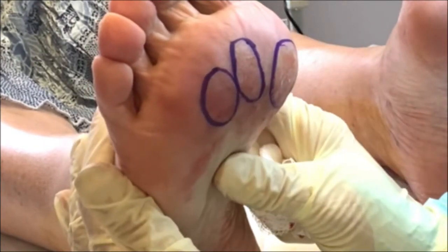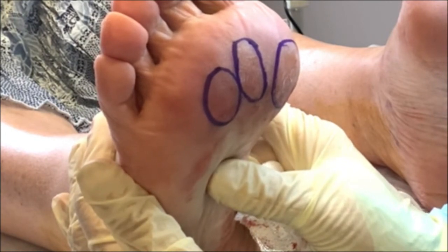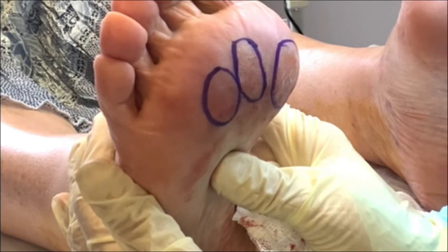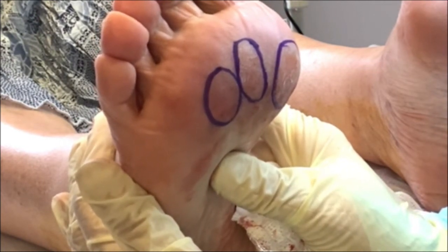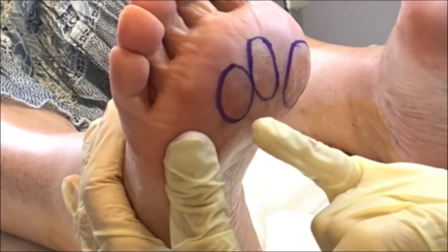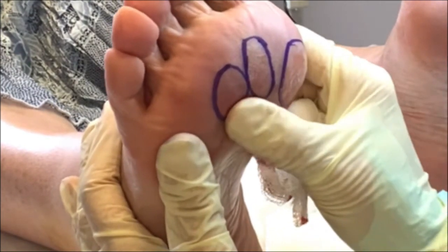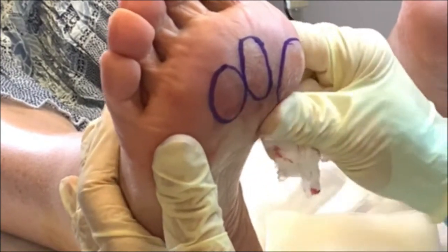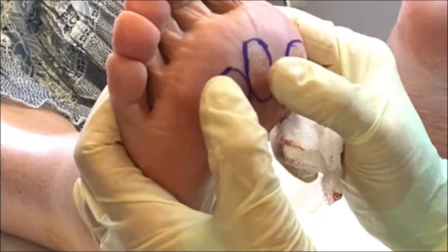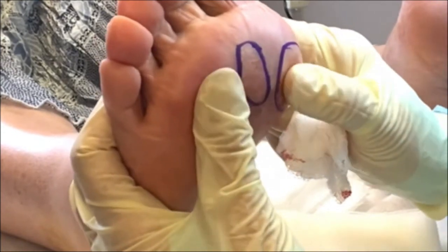So finally, the anaesthetic tibial ankle blocks are going to be wearing off within the next three hours. I want my patient to take it easy for the rest of the day. And for the next couple of days, no high heels. I'm going to be padding this area just to take some pressure off. Obviously, the points where I've actually injected the fillers, that's going to feel a bit bruised. There's going to be a bit of bruising, and this is going to pump up even more. Hopefully, this is going to give her that wonderful cushioning and comfort that she needs.